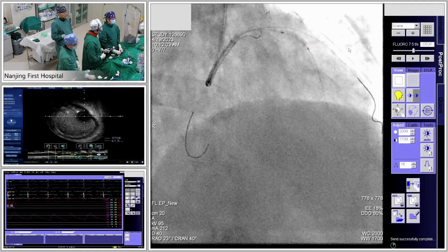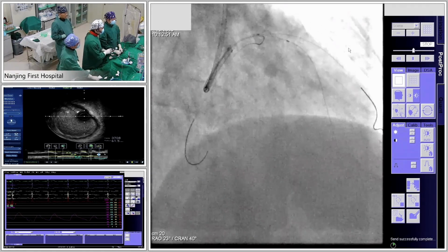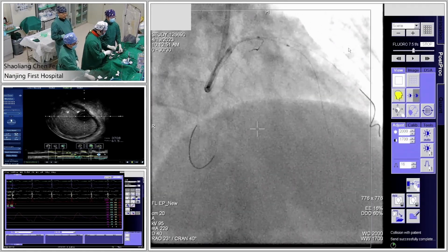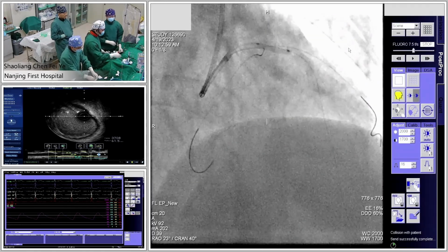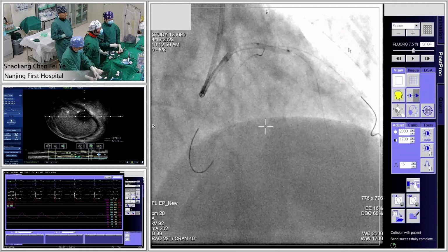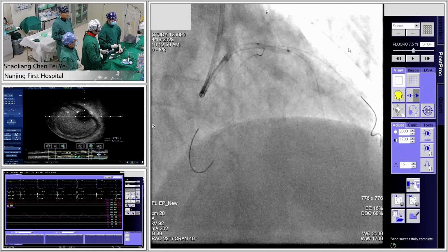Two more additional questions. First one is, why do you use IVUS but not OCT? Second one is, because it's a trifurcation, a cutting balloon or even a scoring balloon has the potential of avoiding plaque shift. Did you try to use a cutting or scoring balloon? Yes.